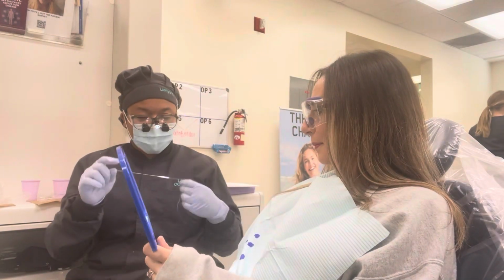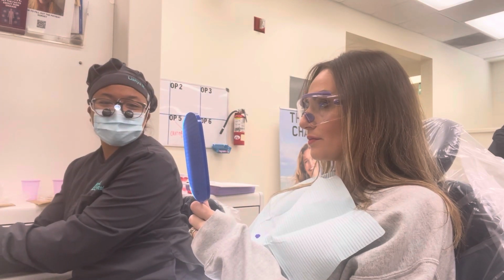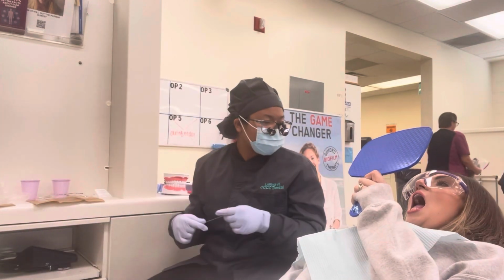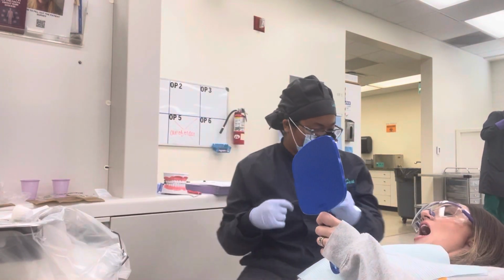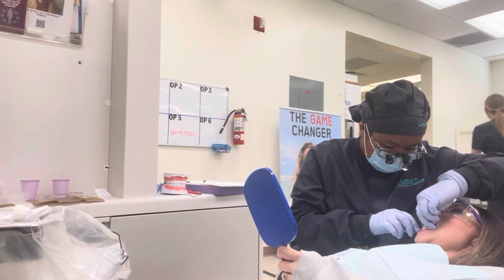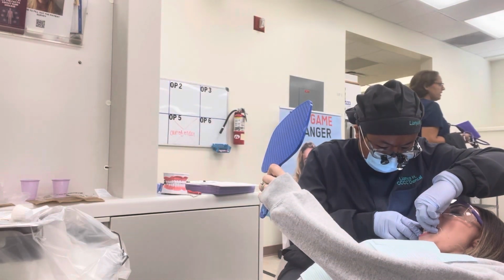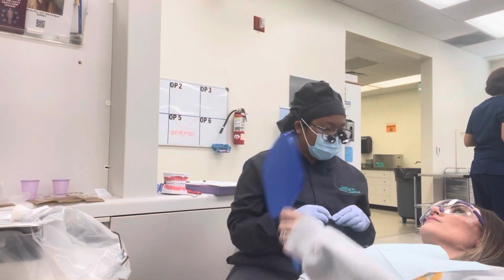Okay. So I can try it on you so you kind of know what it feels like. I don't know if you'll be able to see in there. Just do this. I'm just going to dip. There we go. So just so you know what it feels like, seesaw, up, down. And if you can see a little bit, I'm under that papilla. So it looks like I'm under your gums, but does it hurt?